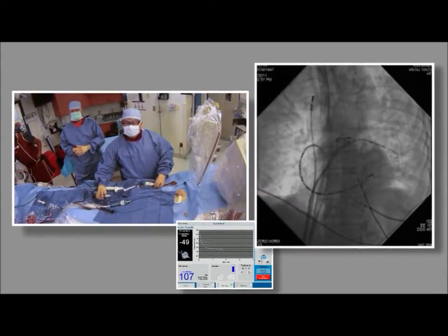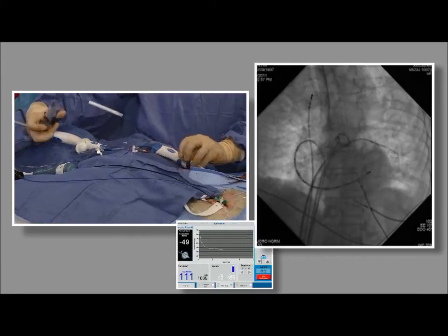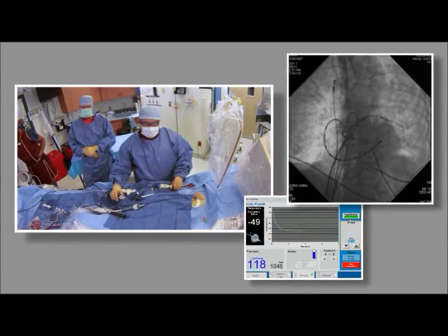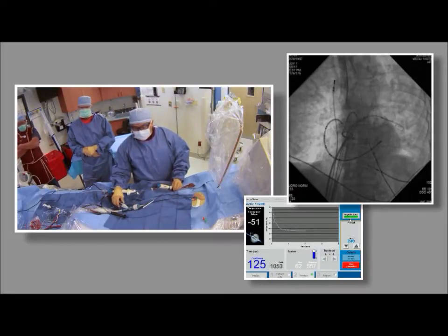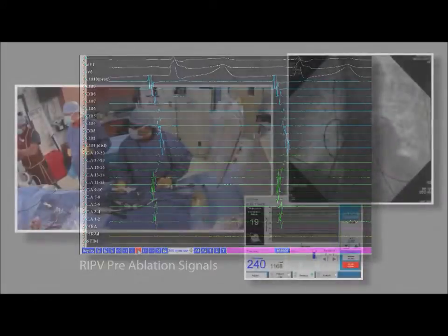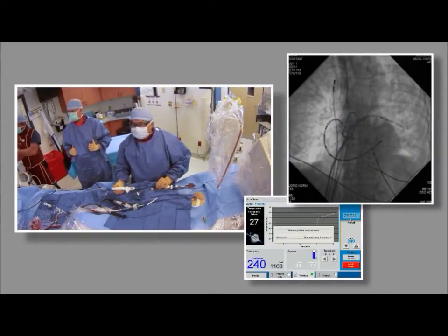During the second freeze of the left inferior pulmonary vein, Dr. Hsu gets pre-ablation signals of the right inferior pulmonary vein. He marks the inferior first to guide the ablation. Dr. Hsu completes the left inferior pulmonary vein ablation and moves to the right inferior pulmonary vein.